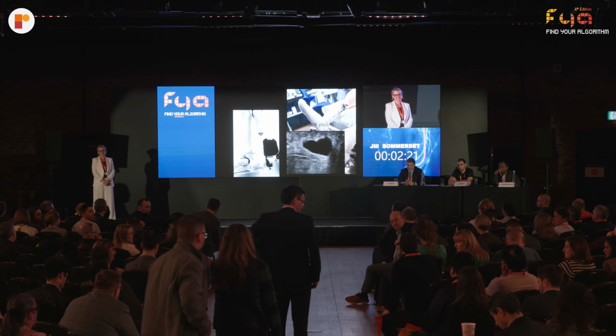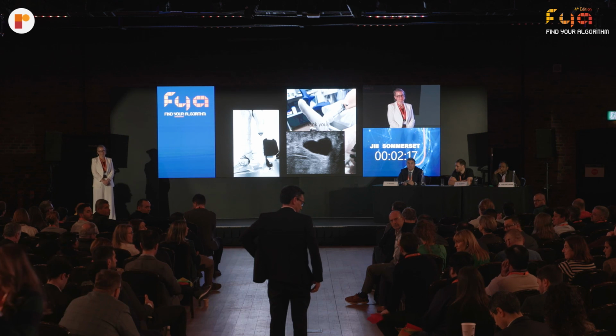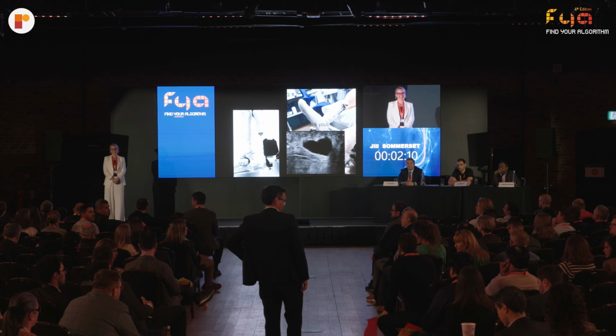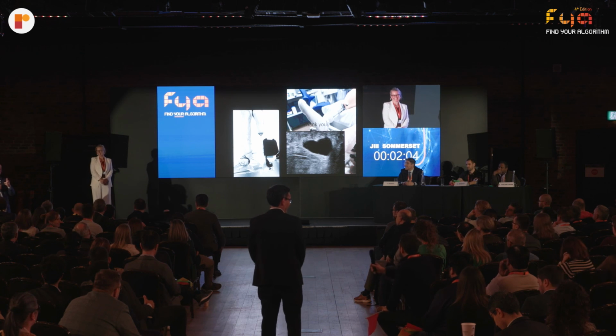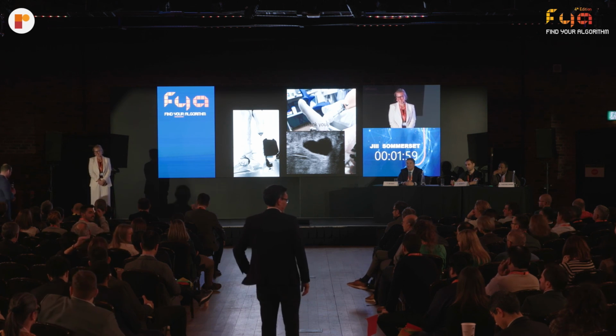But my one tip is do it before you take the sheath out, because when you do the PAT whilst you're pressing on the groin, you get really poor pictures. Yes, and even afterwards. I was trying to work out why it was even now class 4, but I did such a great job. And they're compressing. It's also difficult. And then my reg said, I think you're pressing too hard. If you remove the sheath, it's also difficult then to improve the flow. Exactly. So it's just getting the timing right.